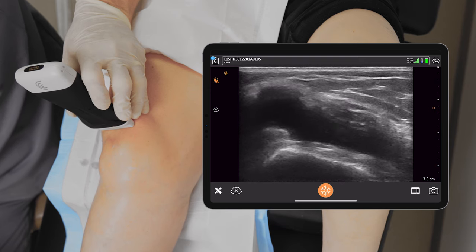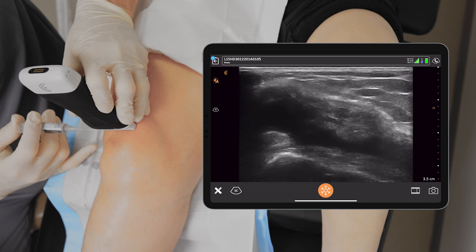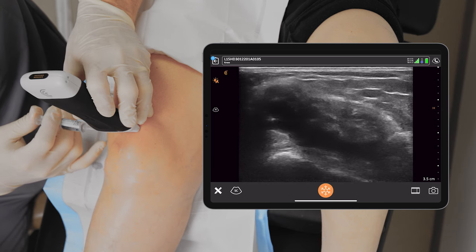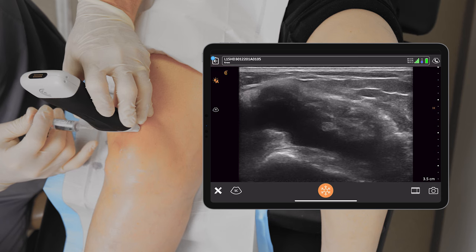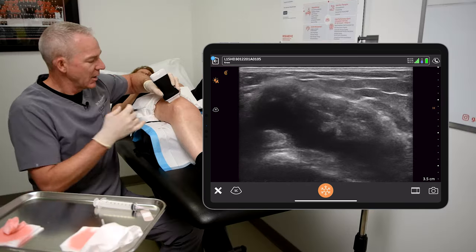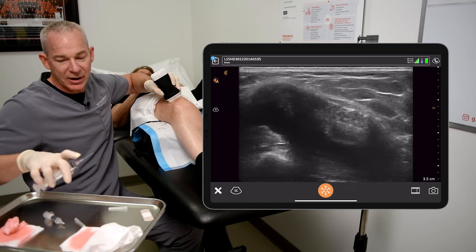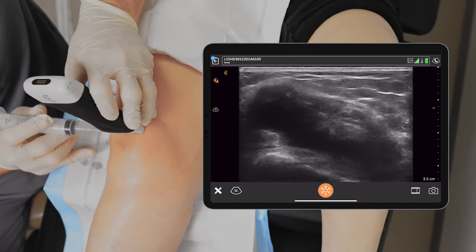I then take a little bit of anesthetic, put a small wheel in the skin, and pass the needle through the vastus lateralis and the iliotibial tract into the effusion. I freeze up the needle track on the way out, and the lidocaine works almost instantly. I'm then ready to take an 18 gauge 1.5 inch needle and pass it through the needle track.